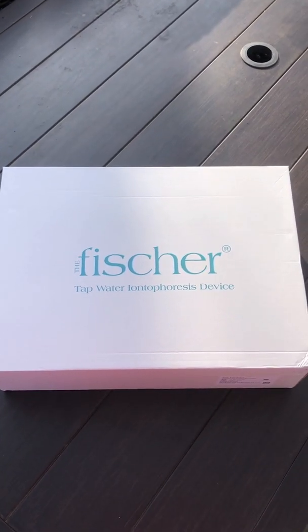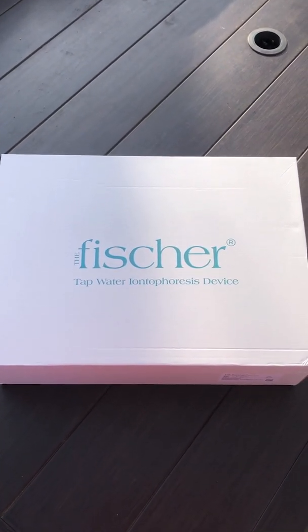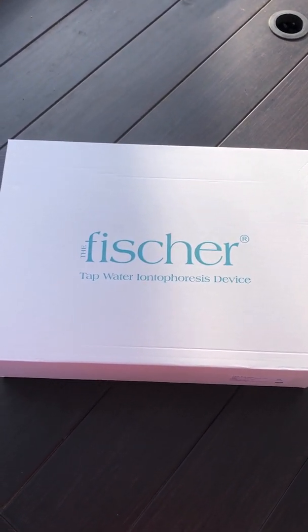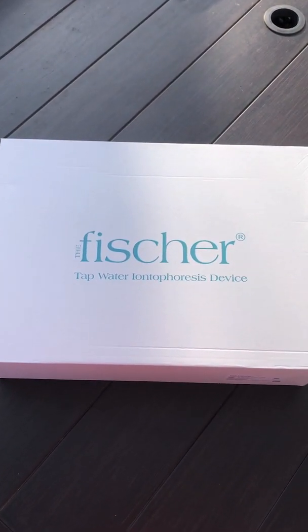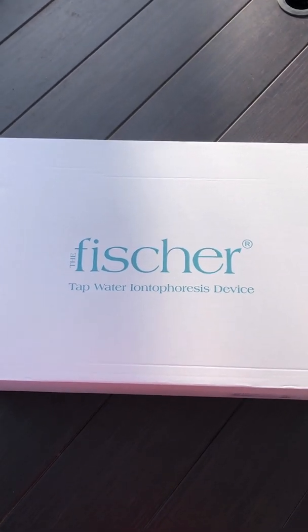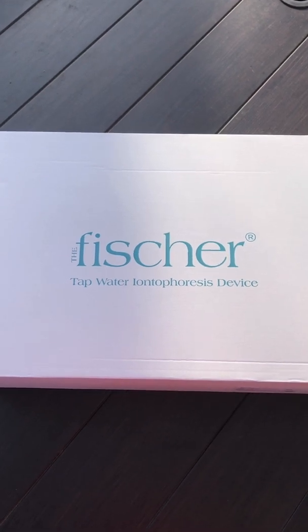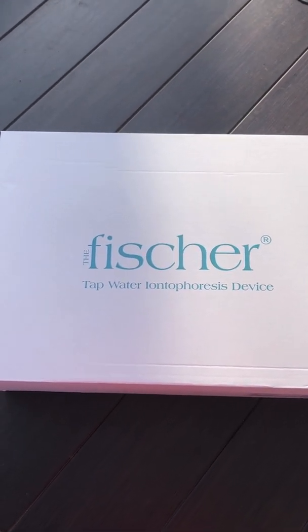Hey everyone! Today I'm going to be unboxing my brand new RA Fischer Iontophoresis machine that I will be using to help treat my excessive hyperhidrosis. I'm super excited to try this out and see results because it's using brand new technology which will really change the approach for Iontophoresis in general.